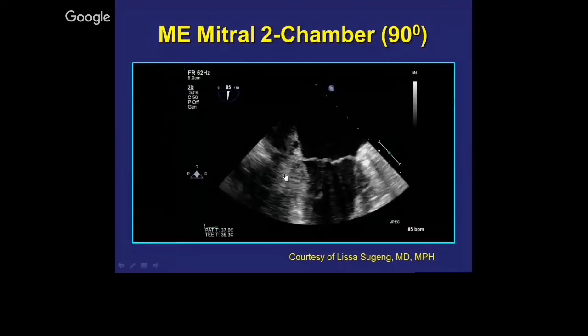But I suppose it's looking at the angle, isn't it? And to spot when your anaesthetist is doing that, or your cardiologist. I suppose it's just getting used to it.